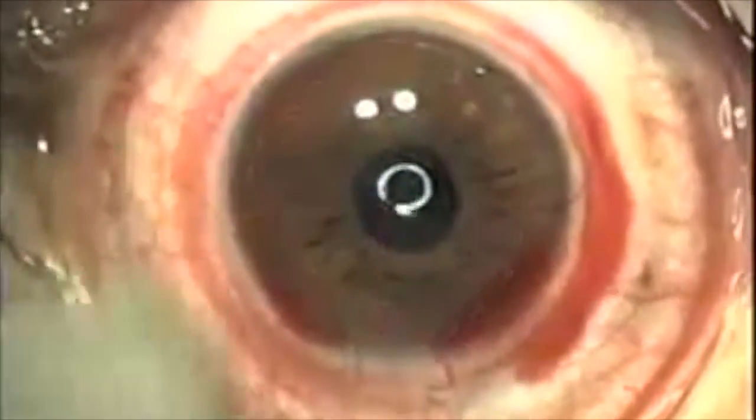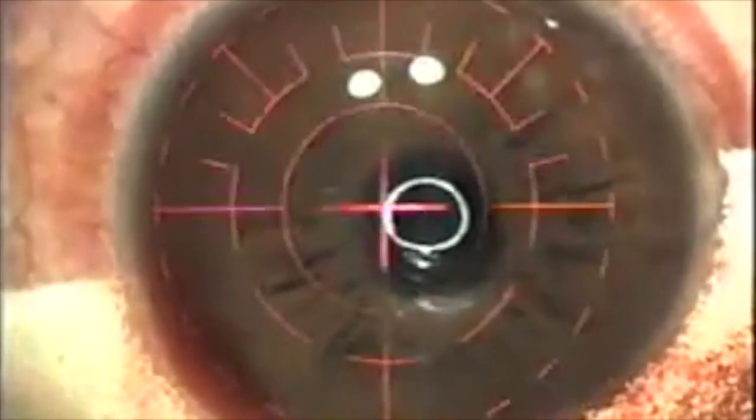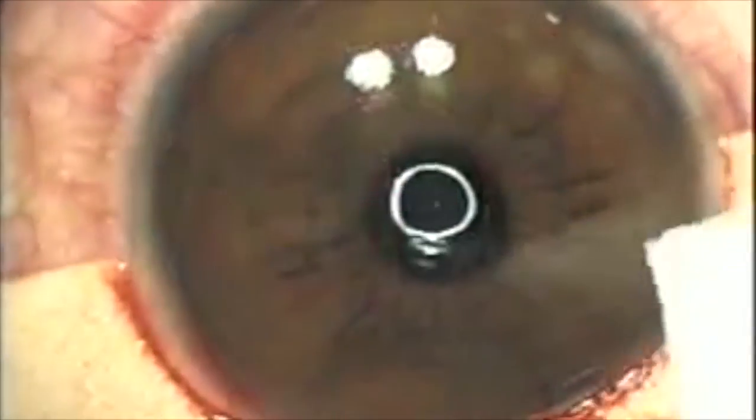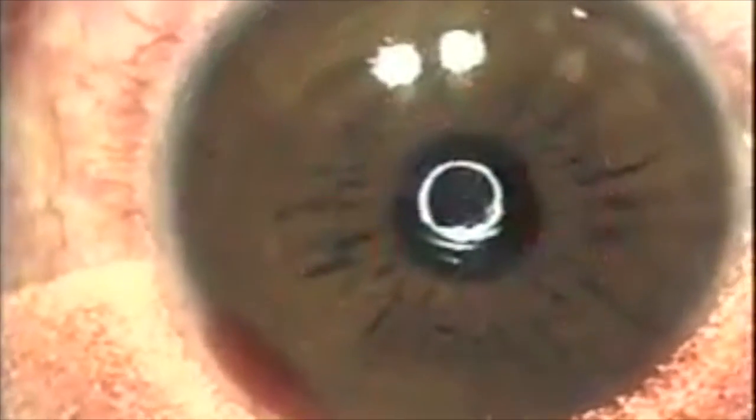Bleeding might occur, but it'll go away within a few days after the procedure, and that's perfectly fine. And what the surgeon's doing now is trying to soak up the excess blood. The surgeon is now getting ready to remove the corneal flap that he has cut. The surgeon is just getting rid of any excess fluids that are around the cornea so that none of it can get into the actual stroma of the eyeball.